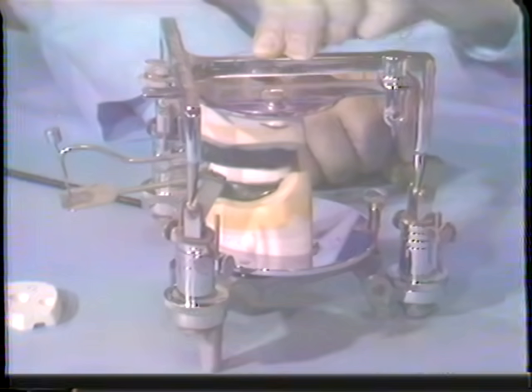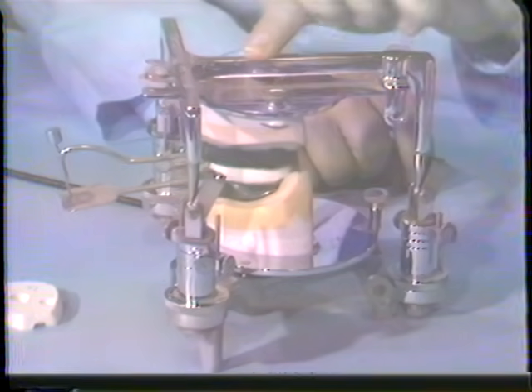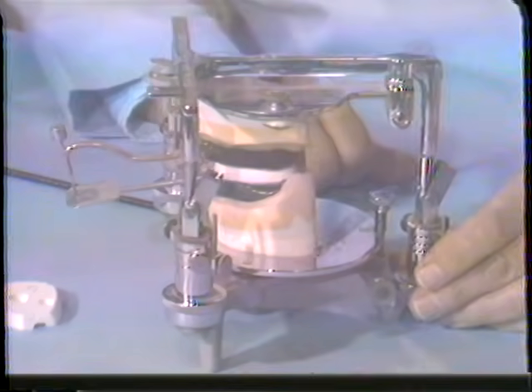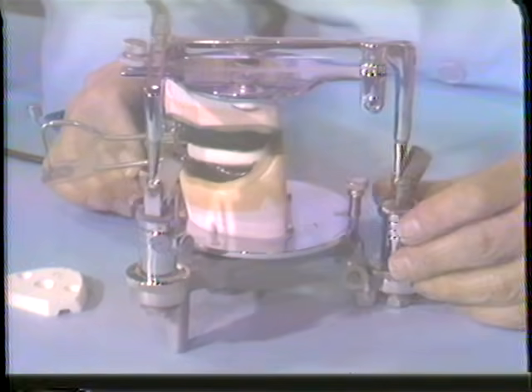One record that is not necessary on this particular instrument is a Facebow transfer. We're using it as a tripod, really. The instrument would be programmed to these positions, so we really don't need a Facebow transfer because of the design of the instrument, the way it is designed to function. So a tripod instrument does not necessarily require a Facebow transfer.